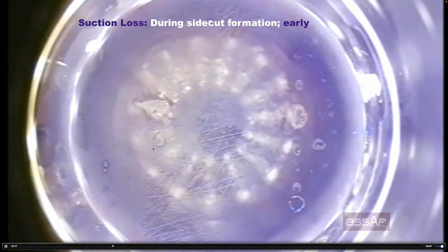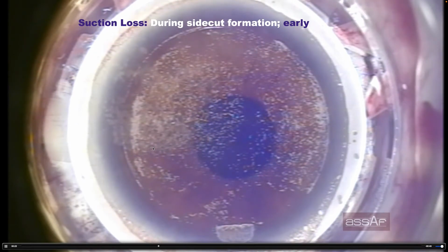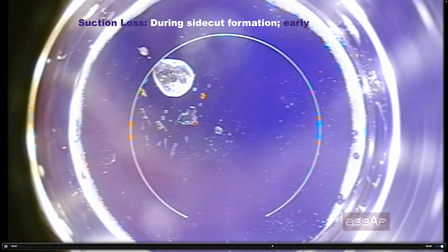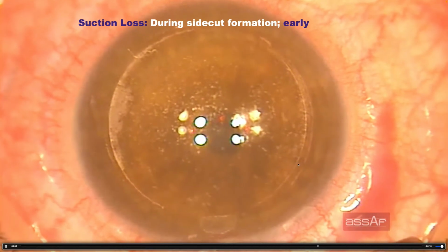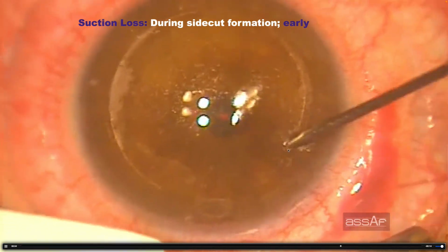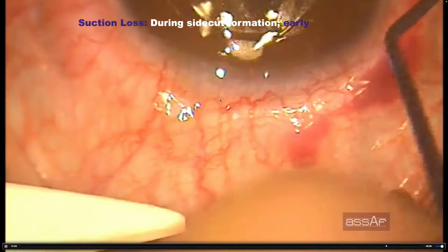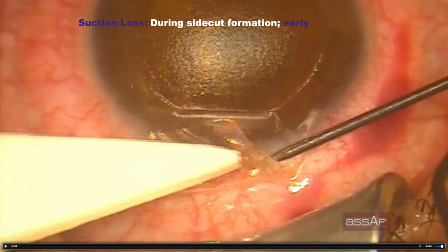after applying the suction ring and the glass cone on the ocular surface, applanation of the cornea, the laser is firing now, and there you can see nothing because the laser energy for the bed is reduced toward the minimum. And now this is the side cut. The new side cut has been formed within the incomplete original one. And after removing the suction cone, you can see this is the newly formed side cut of smaller flap diameter within the borders of the incomplete side cut from the first application of the applanation cone. And we can proceed forward for LASIK.